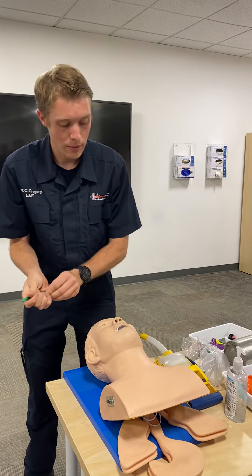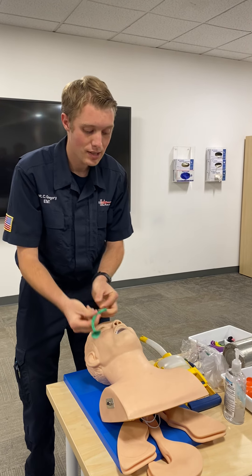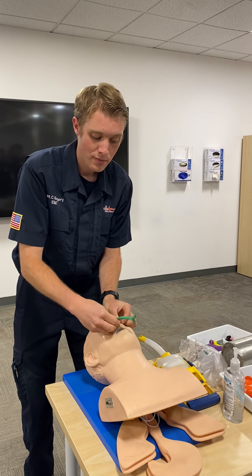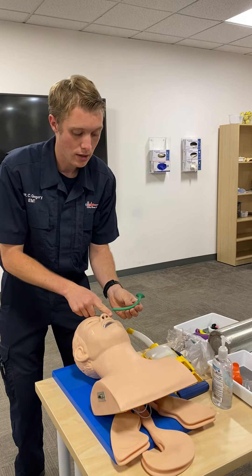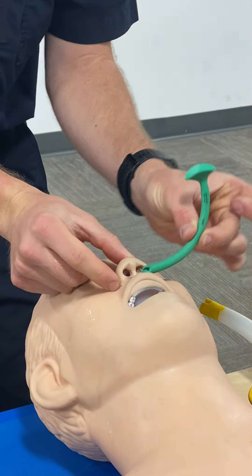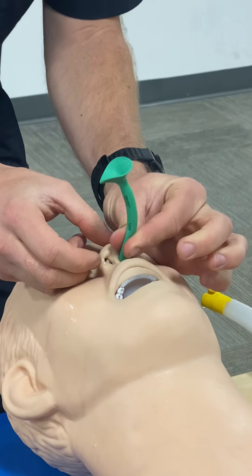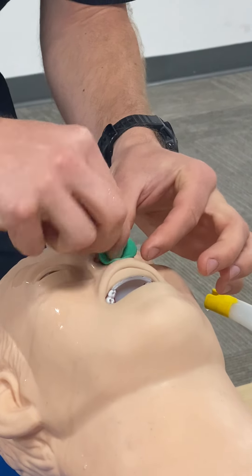You're going to lubricate the NPA a little bit, then take the bevel — that cut-out side — and orient it so the bevel faces the septum. Going in the right side of the airway, stick it in and push all the way down. If going into the left nare, you have to go in upside down, anti-anatomically, so the bevel still faces the septum. Insert about an inch and a half until you feel resistance, then twist and push the rest of the way anatomically.